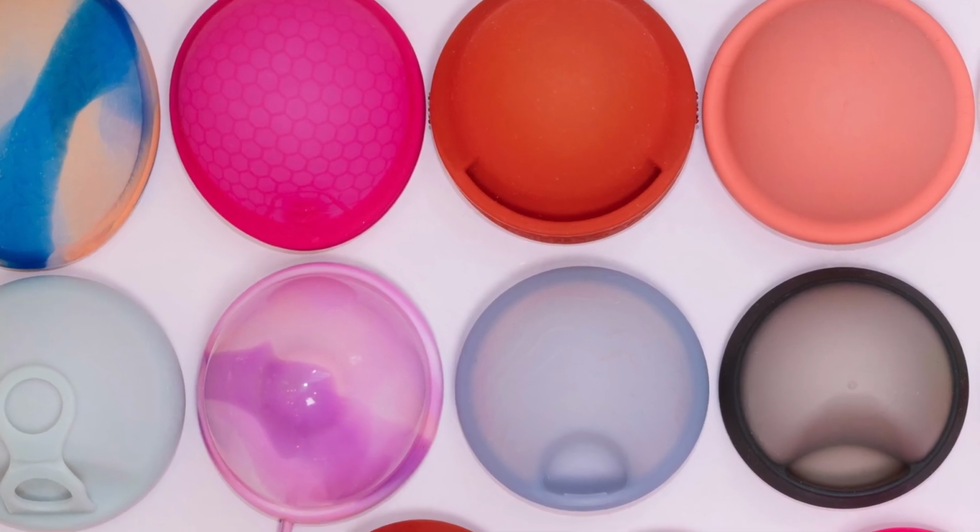That means as a pro, it's more likely to fit you on your first try. You could get any menstrual disc as long as it's one of the one size options or the larges, and it's most likely going to work for you and not leak for you and fit you, meaning you don't have to trial and error through so many options. I keep saying most because that's not everyone's experience, but your likelihood of it fitting you on the first go is certainly higher, and that's a pro.